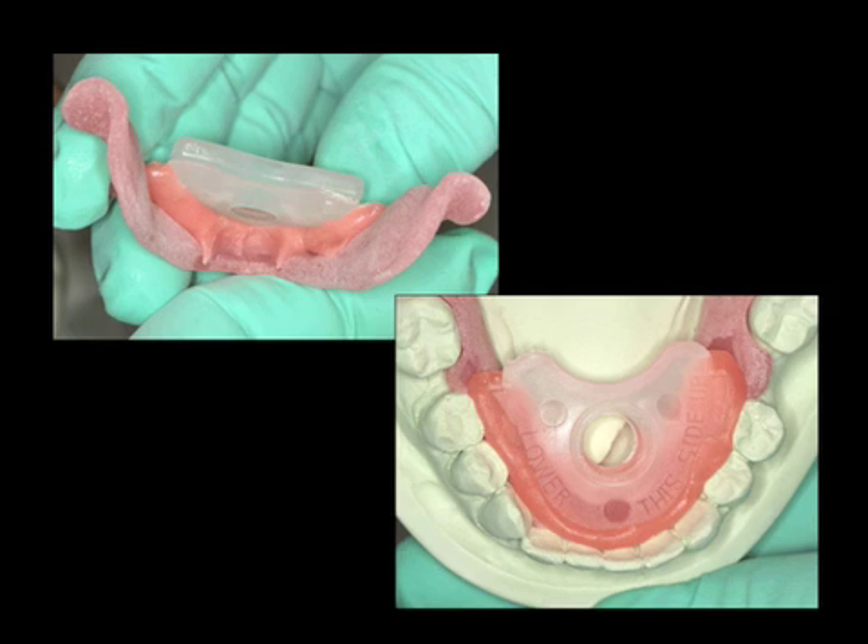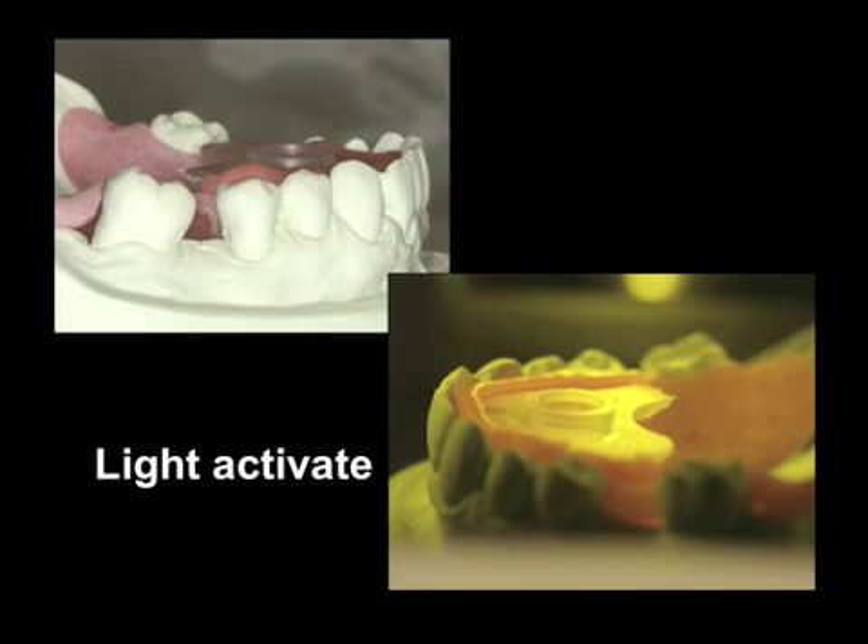In the right area of the slide, we need to put a small amount of resin over the top of the striking plate in order to secure it. Once this has been done, we will then light activate.